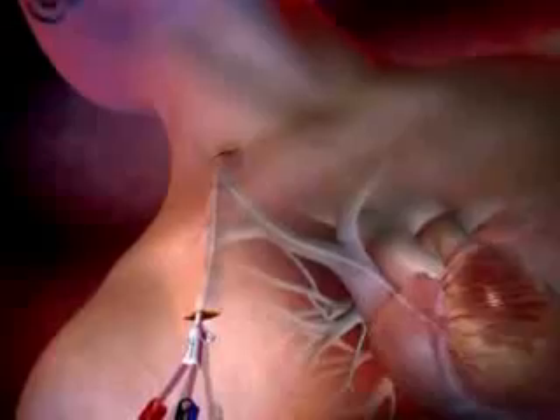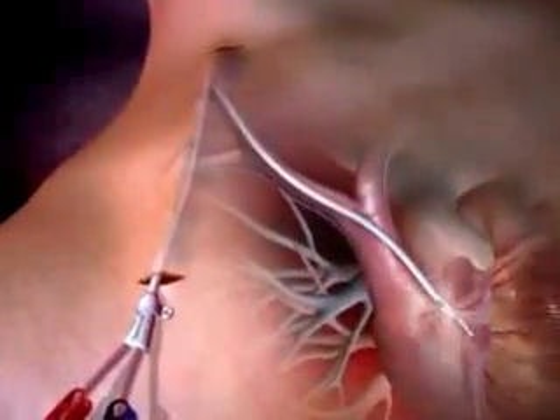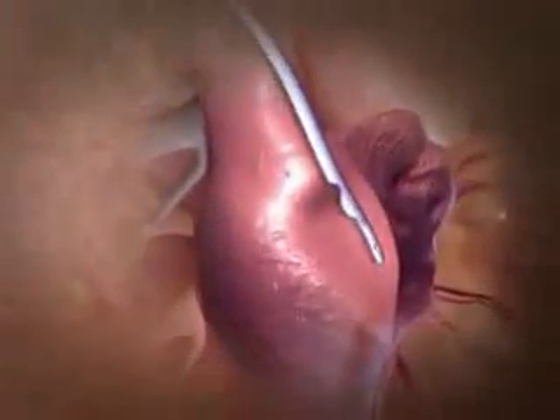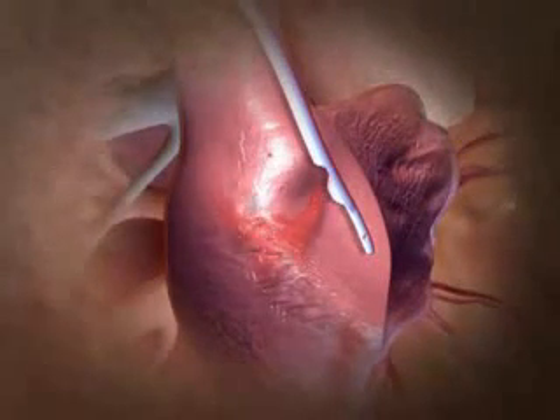The unique design of ProGuide, specifically the apposition deflection feature, or bump, reduces the risk of it lying directly against the vessel wall or wall of the heart. The benefit is that it provides smooth, uninterrupted flow of blood through the catheter.